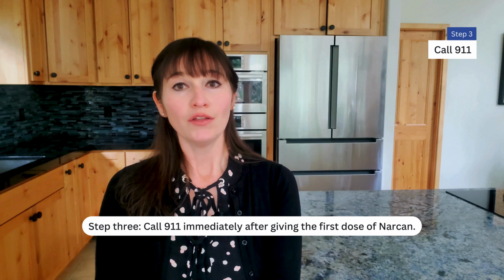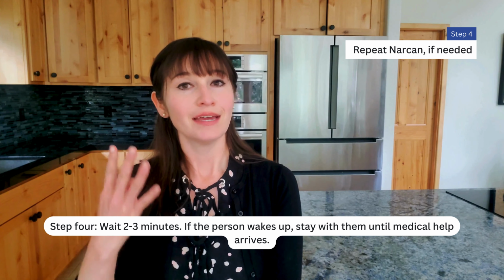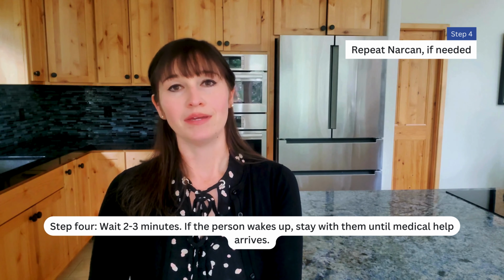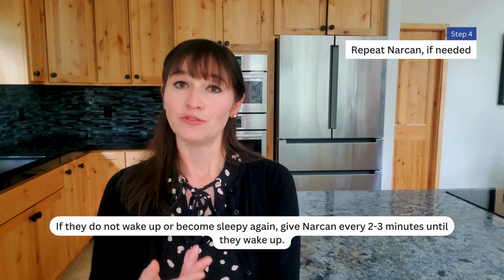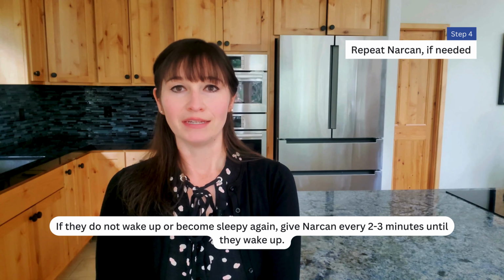Step 3. Call 911 immediately after giving the first dose of Narcan. Step 4. Wait 2 to 3 minutes. If the person wakes up, stay with them until medical help arrives. If they do not wake up or become sleepy again, give Narcan every 2 to 3 minutes until they wake up.